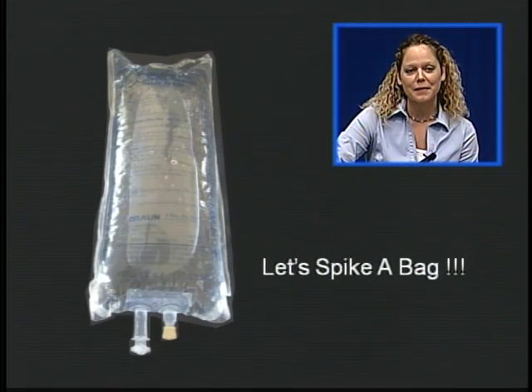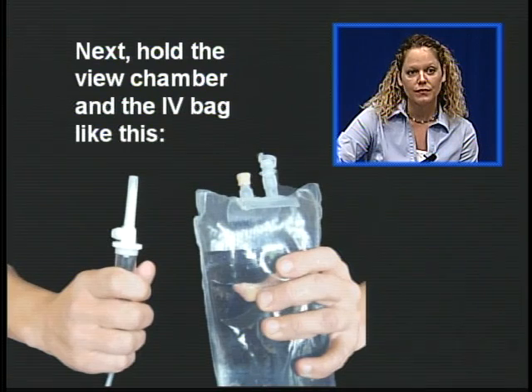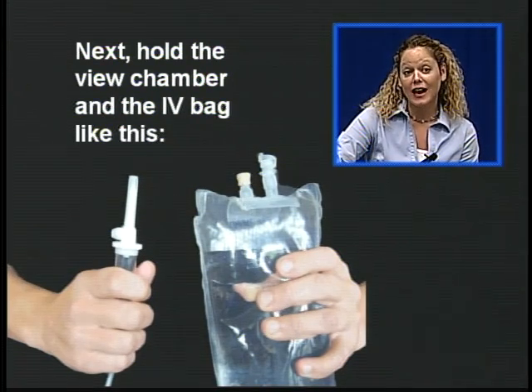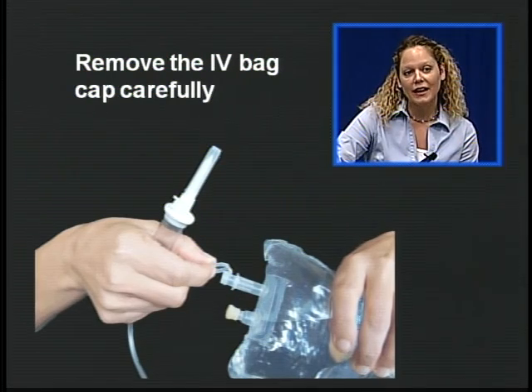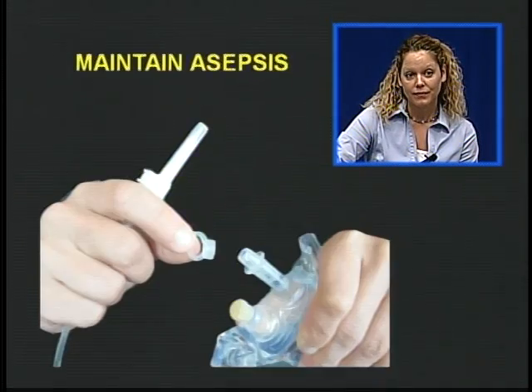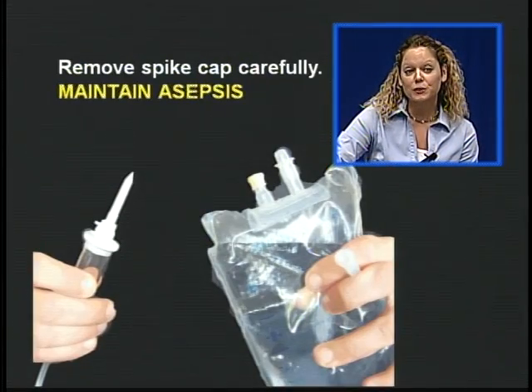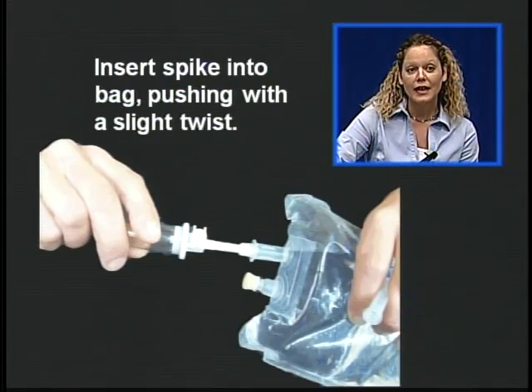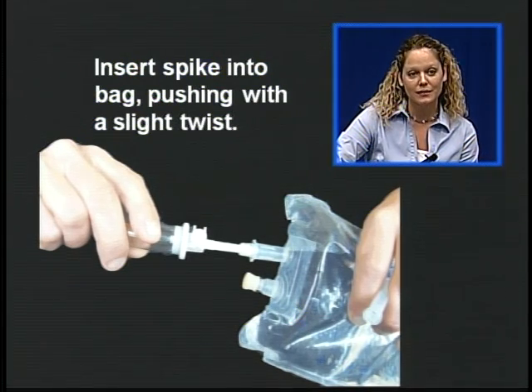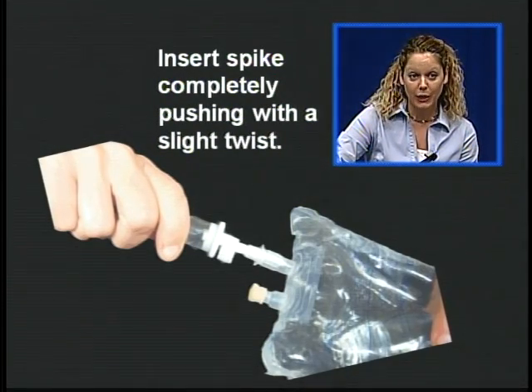So let's spike a bag. First, close the roller clamp. Next, hold the drip chamber and the IV bag like so. Remove the IV bag cap carefully, maintaining asepsis. Grasp the spike cap like this and remove the spike cap carefully, maintaining asepsis. Insert the spike into the bag, pushing with a slight twist. Insert the spike completely, again pushing with a slight twist.